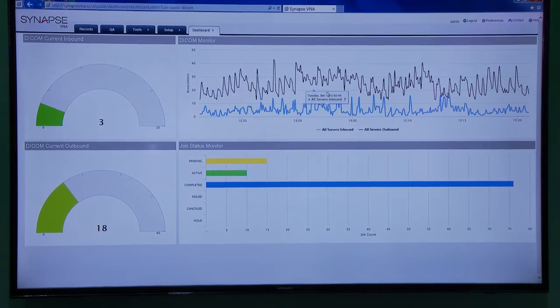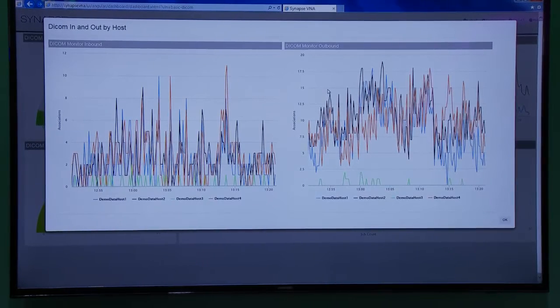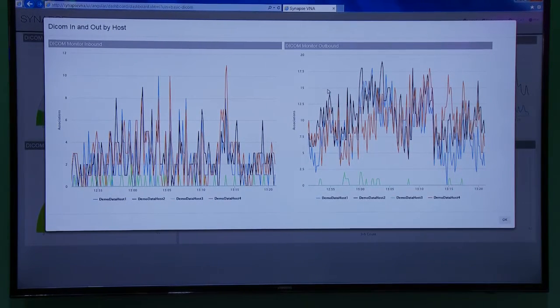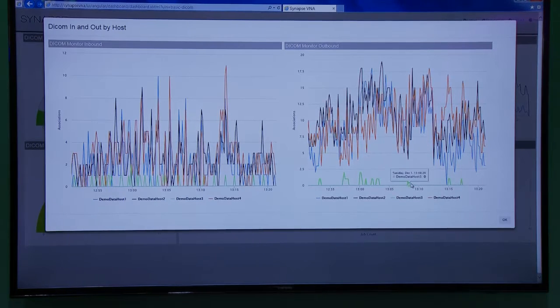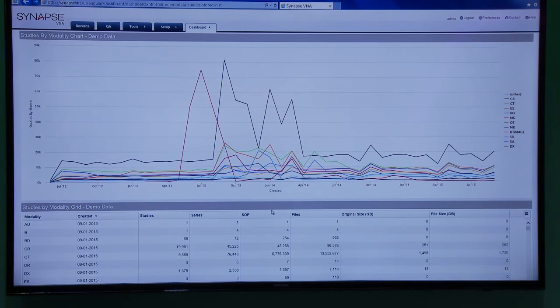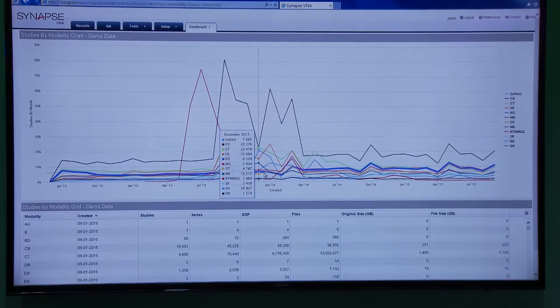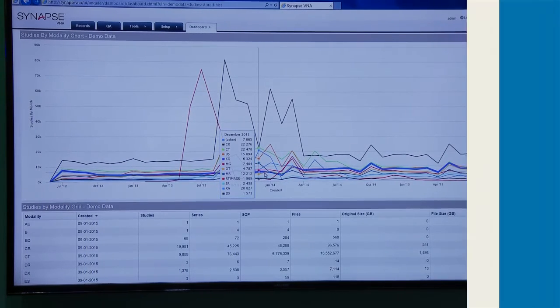I can also provide click-through looks into more detailed information about the VNA, such as DICOM associations per server. The VNA is also able to provide historical views of data usage over time, viewable by modality or organization, as well as predictive volume usage over time.